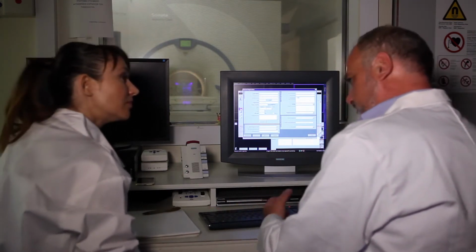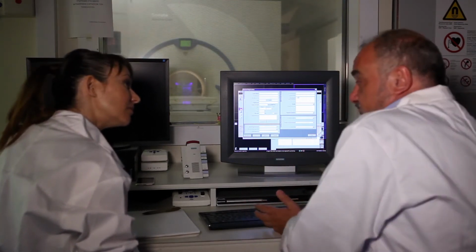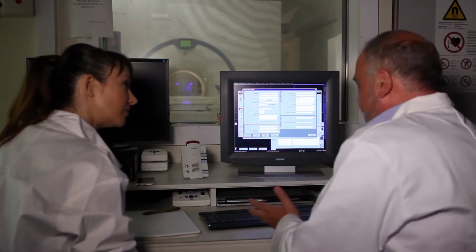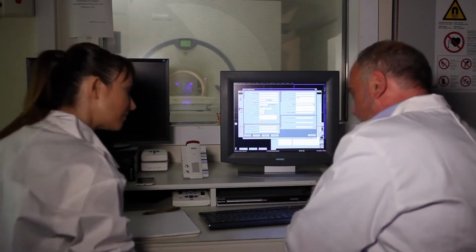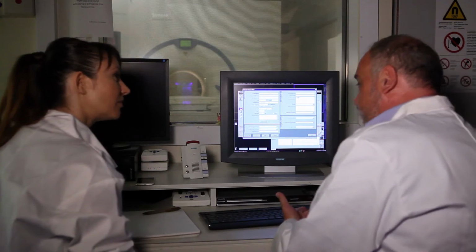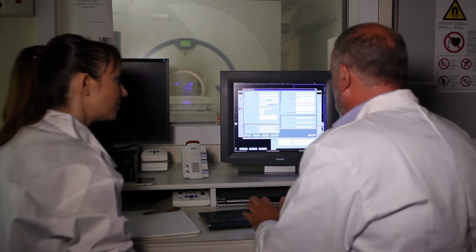Because the plastic part, the external housing, is plexiglass, and plexiglass, of course, doesn't absorb anything. It cannot be seen in a magnet. Everything which is solid cannot be seen in a magnet. So only the liquids have the signal. But the liquids have to have specific conductivity in order to absorb the RF. So the power has to be at a specific level. That's why we use this choice.